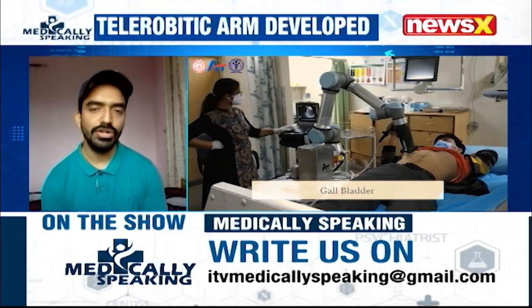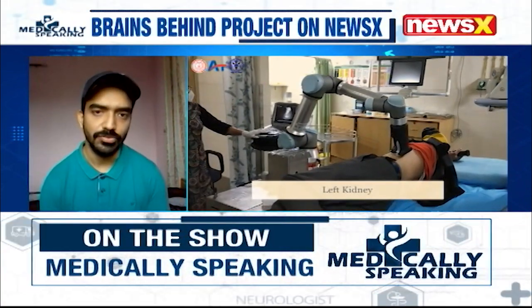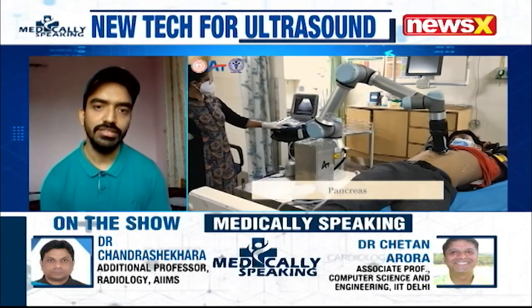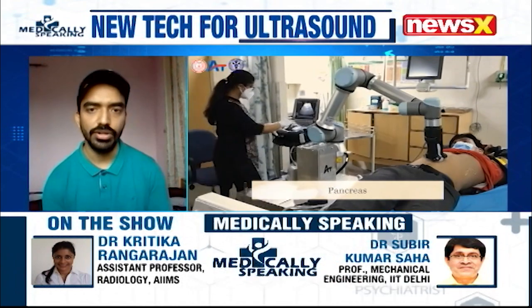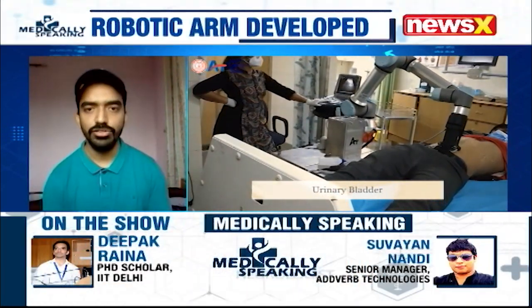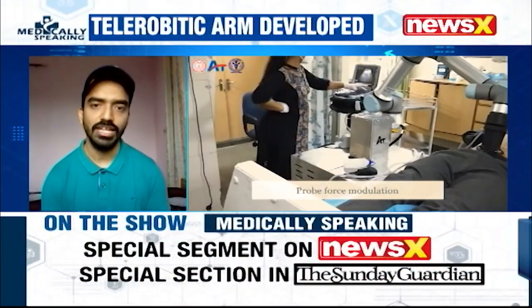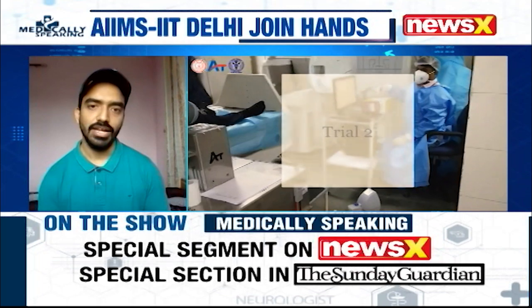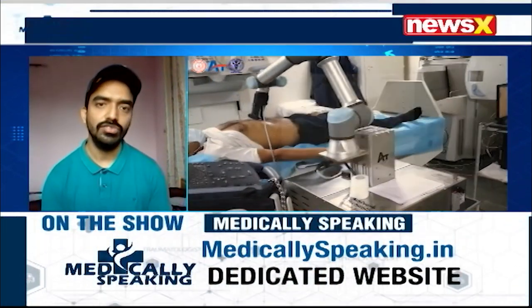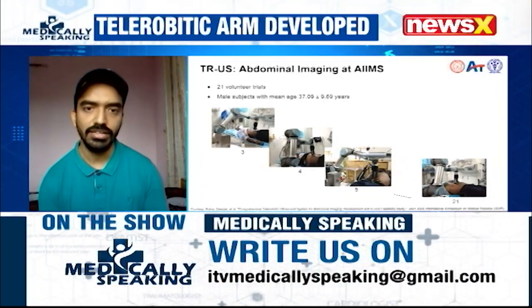There are various components that are merged into this system. As Professor Chetan has mentioned, there is force feedback. You need to ensure that there is proper positioning and orientation of the probe, and the proper pressure is applied, and that too in a remote setting. That brings more challenge into the system, and I think we accomplished it, and we got the quality of the system and the quality of the ultrasound imaging comparable to the conventional technique.